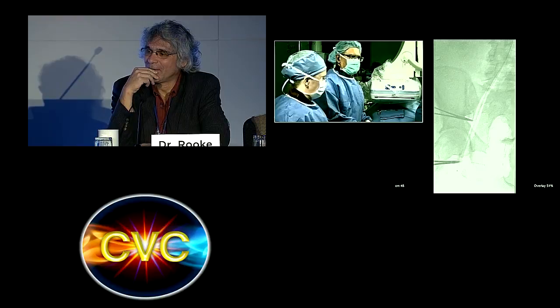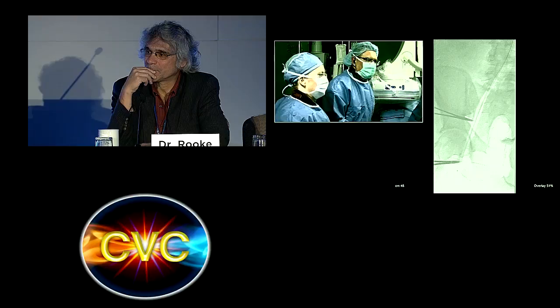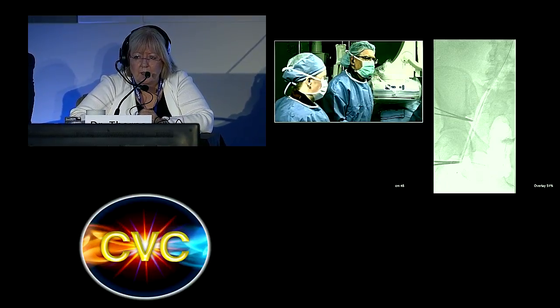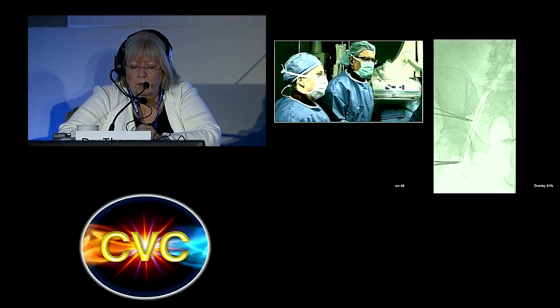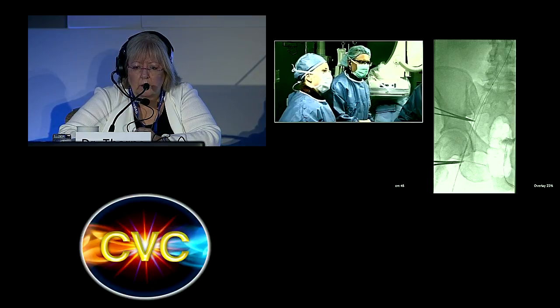Seems a little long, but we can try to accommodate this. You know, in my experience, Julio, I never get into trouble with too long of a stent, only too short of a stent. Yeah, I know it's going to foreshorten some more. After I touch it with the balloon, it will probably get into the needle. I know that's still way below that marker that I chose.